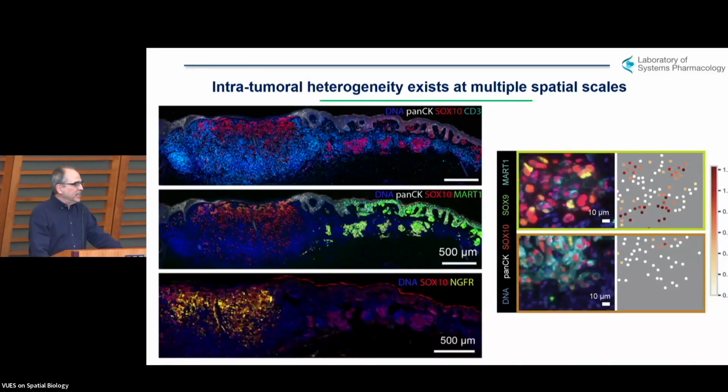And here's just a little example of this kind of intratumoral heterogeneity. This is a single patient specimen. It has a couple of different disease stages. And what I want you to see is two things here. One, on the left, you can actually see dramatic differences in, and these are, by the way, differentiation-associated proteins. Some of them are used diagnostically. And you can see that over this specimen, which is a couple of millimeters, you have a dramatic difference between green and red. Both of those are tumor. They would look roughly the same in H&E.